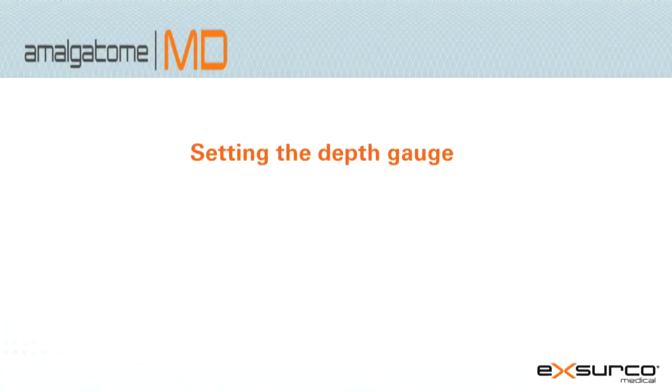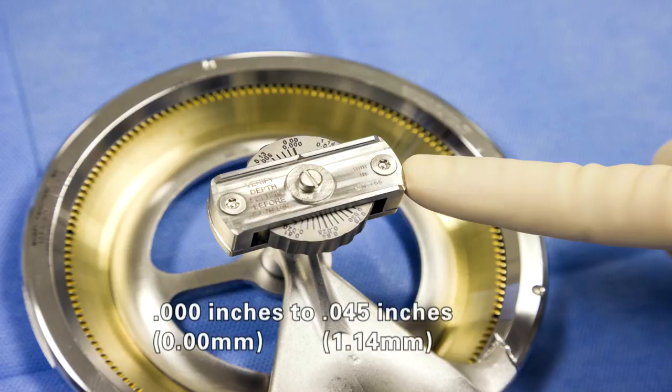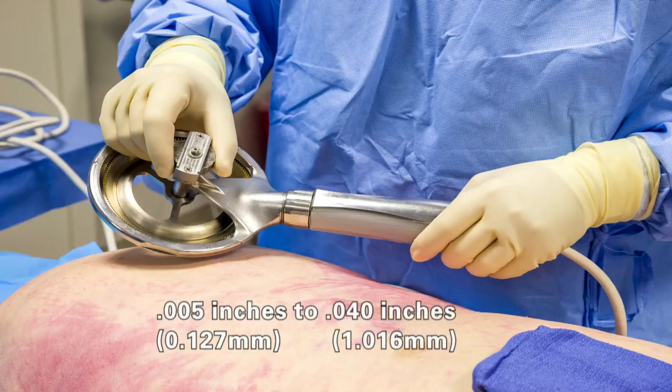Setting the depth gauge. The Amalgatome MD depth gauge is designed to have a functional range of 0 thousandths of an inch to 45 thousandths of an inch. However, the recommended excision depth range are settings between 5 thousandths of an inch to 40 thousandths of an inch.